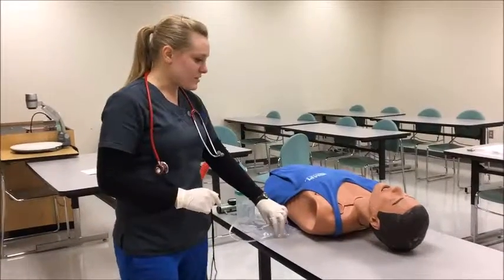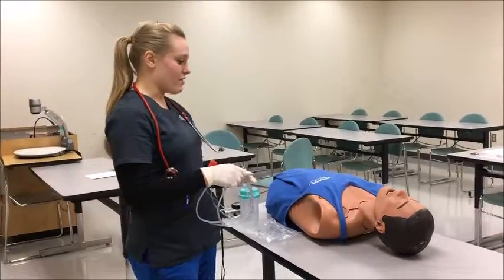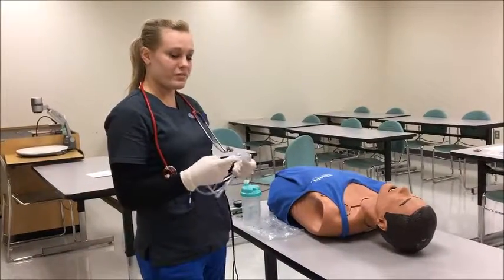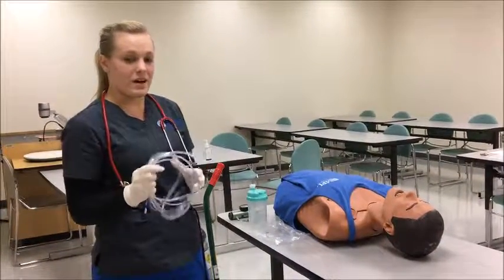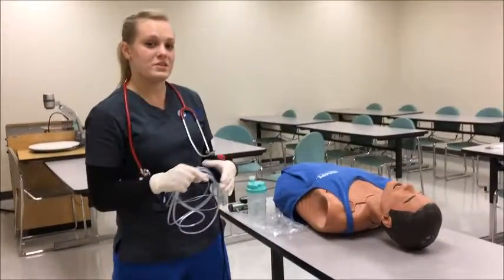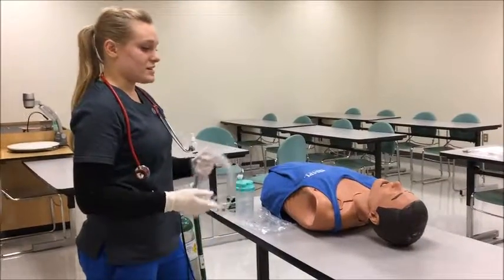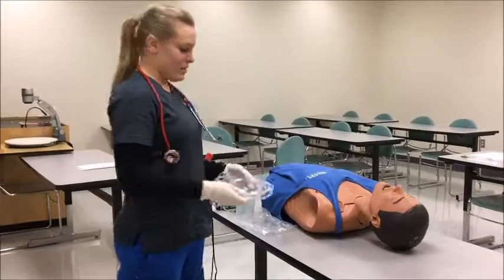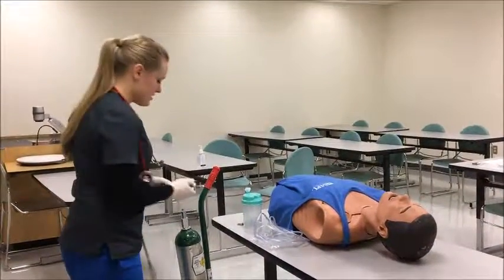I'll be applying your nasal cannula now, and I'll be setting it at 6 liters a minute because you're having increased shortness of breath and low sats, so I'm going to put him at a little bit of a higher flow. For a low flow cannula, 6 liters a minute is the highest it can go. If the patient needs a higher flow or a higher percentage of FiO2, we would put him on a high flow nasal cannula, which has a higher flow and a higher percentage. And this 6 liters a minute would be at 44% FiO2.